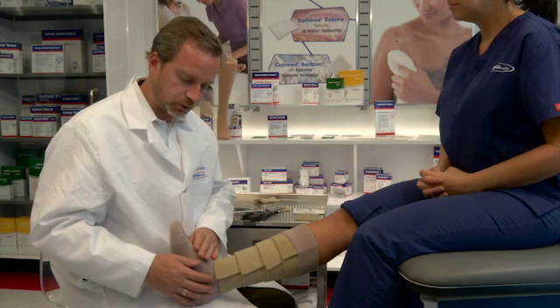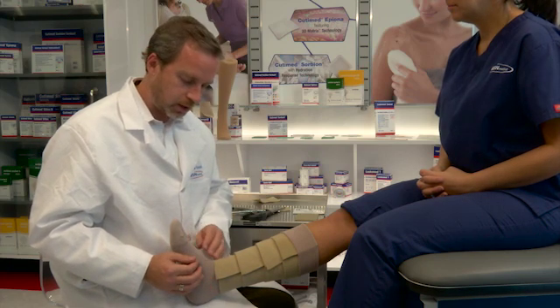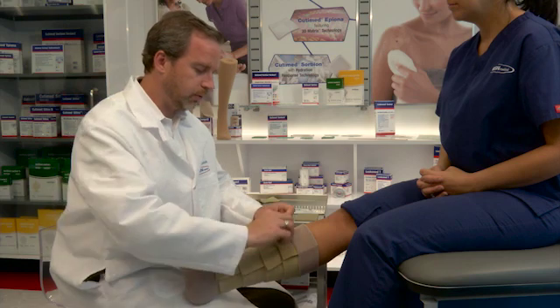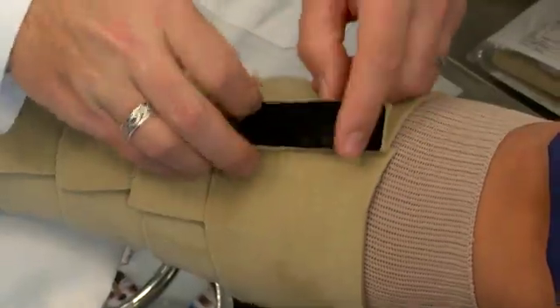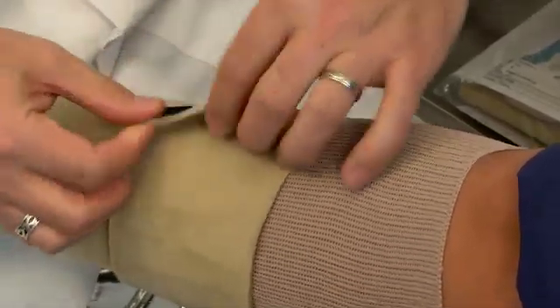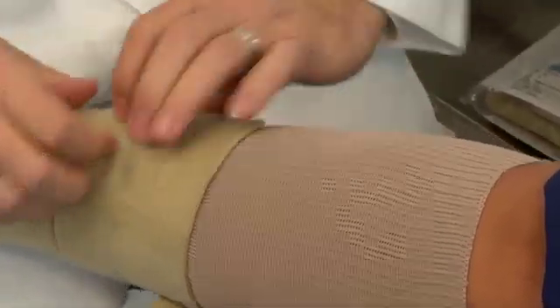Additionally, there is an optional foot piece which also comes with a liner. You would use the foot piece and liner instead of the Farrah Hybrid for patients who have very severe lymphatic swelling of the dorsal foot. In order to remove the garment, you would simply pull the liner up and take each band level and remove it. Always fold it back on itself to prevent it from sticking to other band layers. This makes doffing the garment relatively easy. The Velcro can be removed for washing and then reapplied.